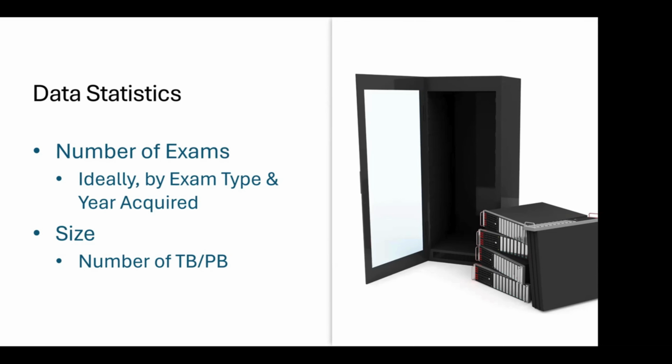Also, if you're dealing with legacy systems that have proprietary data, like the Hologic breast imaging SCO format, and you're going to be converting those to the DICOM standard BTO format, in my experience, the BTO format is like 2.5 times larger once the exam is converted. So you can't make the assumption that the data required to store the legacy data will be the same that's required to store it in the future system. So it's important to consider all of those systems, all of those variables as you're looking at the data.